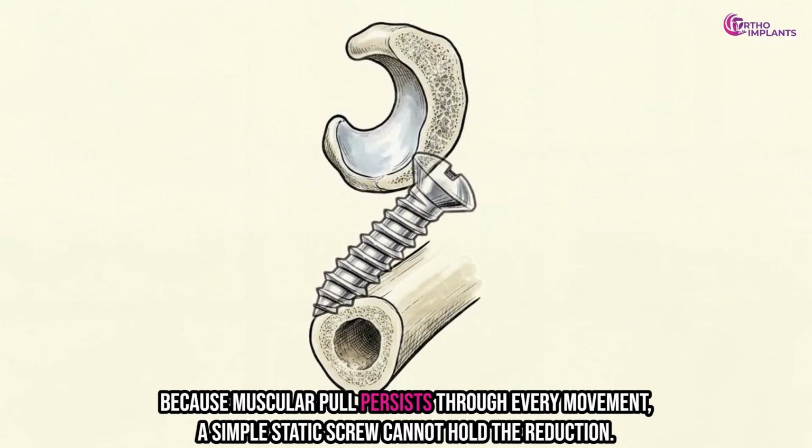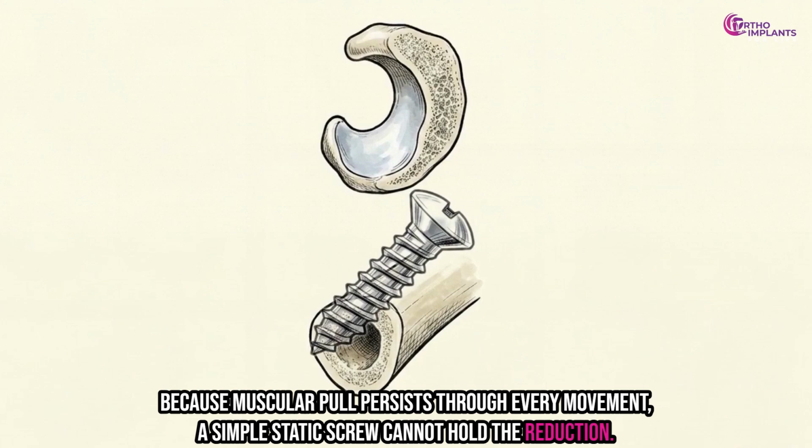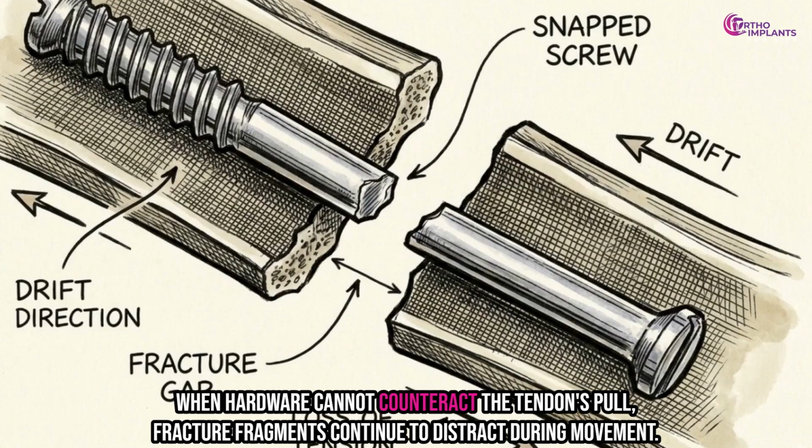Because muscular pull persists through every movement, a simple static screw cannot hold the reduction. The continuous tensile load causes the screw to bend or surrounding bone to microfracture. When hardware cannot counteract the tendon's pull, fracture fragments continue to distract during movement.